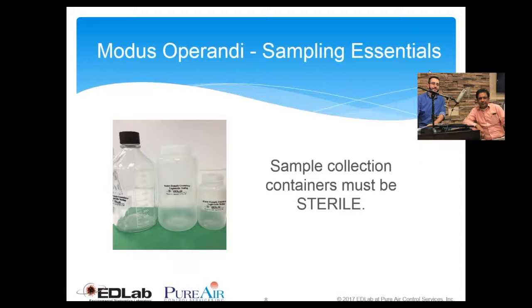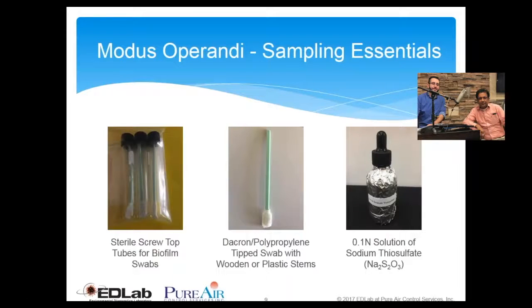Okay, can we use a swab for sample collecting? Sure. A Legionella sample can be collected from the water, from a surface, or sometimes as a bulk sample also. So of course, a swab can be used for collecting especially the surface sample. And for those who are not aware of what the surface sample would be in this case, I can give you some examples later during this presentation.